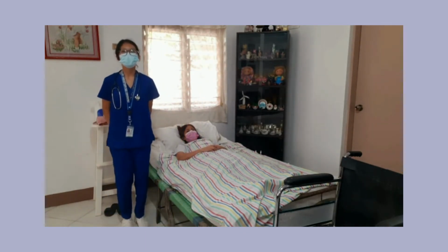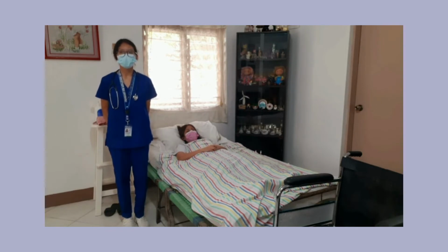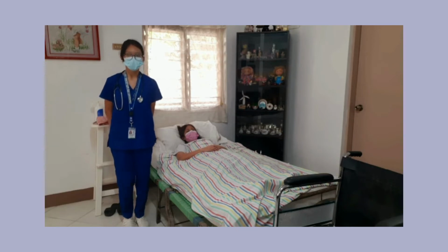Number 4, position the equipment appropriately. Place the wheelchair parallel to the bed, as close to the bed as possible. Put the wheelchair on the side of the bed that allows the client to move towards the stronger side. Lock the wheels of the wheelchair and raise the footplate.